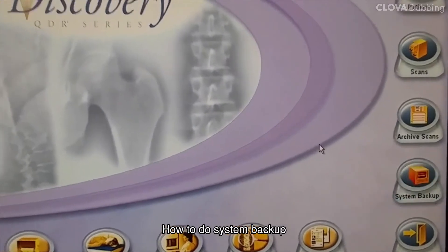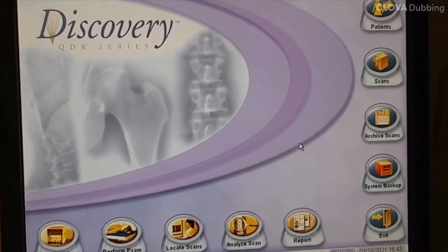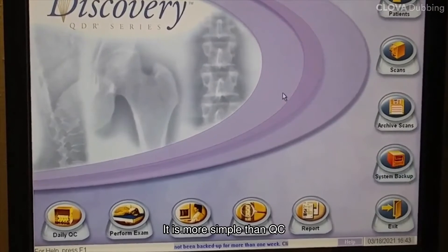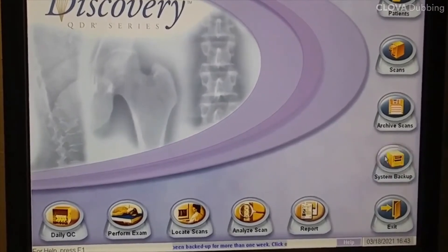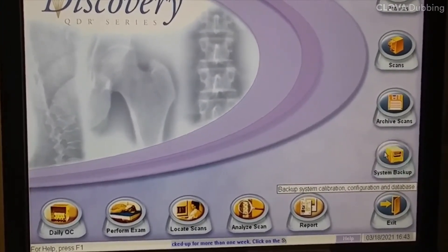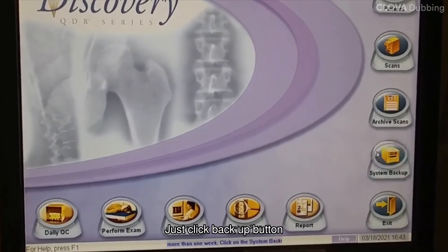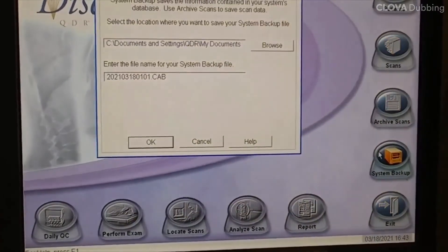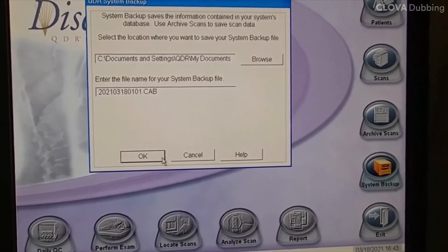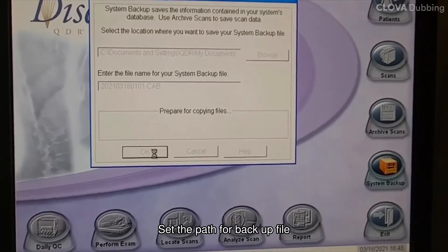How to do system backup. It is more simple than QC. Just click the backup button and set the path for the backup file.